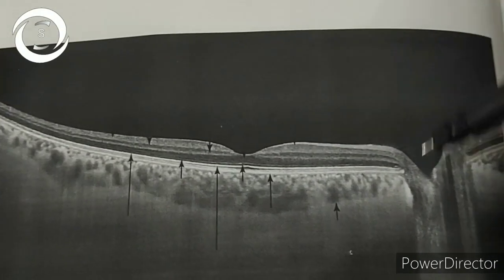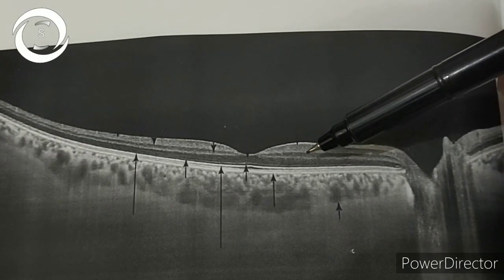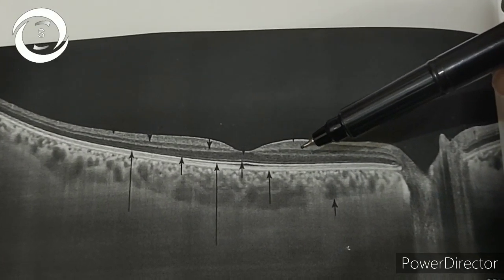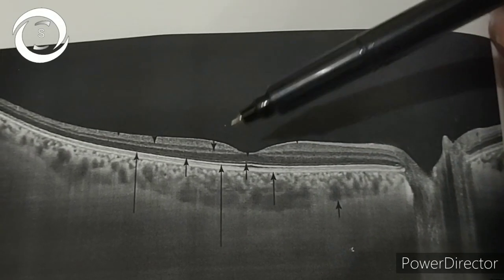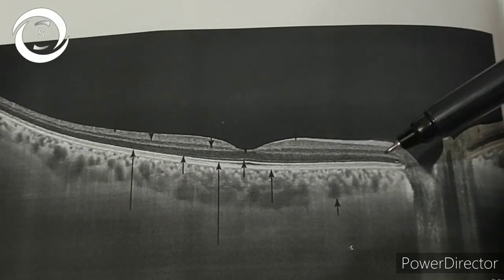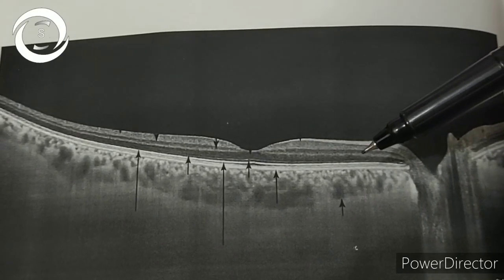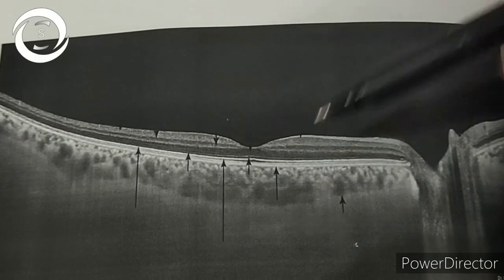Now in the inner retinal layers, the hypo-reflective areas are the inner and outer nuclear layers, whereas the hyper-reflective areas are axons and dendrites of plexiform layers. You should know that.